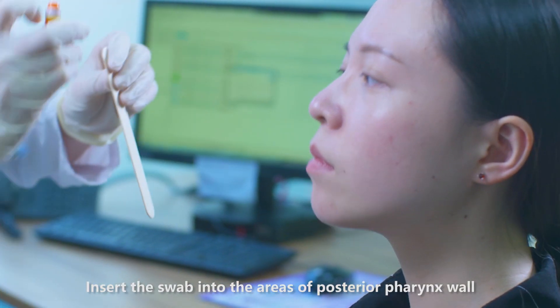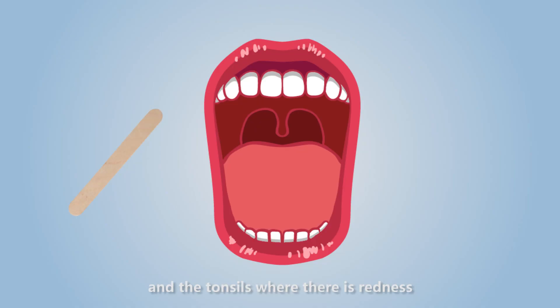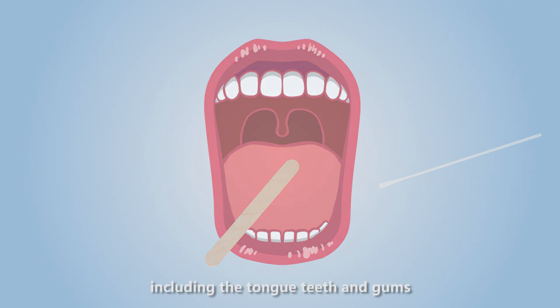Insert the swab into the areas of posterior pharyngeal wall and the tonsils where there is redness. Rub the swab over the areas firmly and gently to obtain a good sample. Remove the swab from the mouth without touching any surface including the tongue, teeth, and gums.